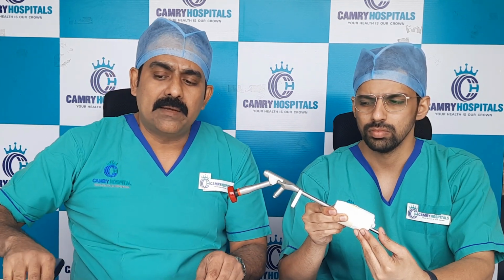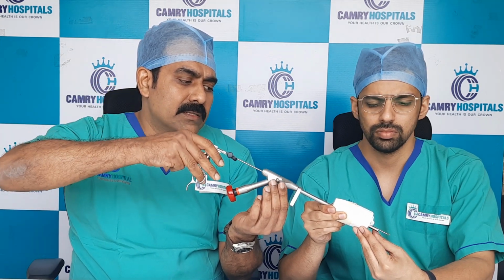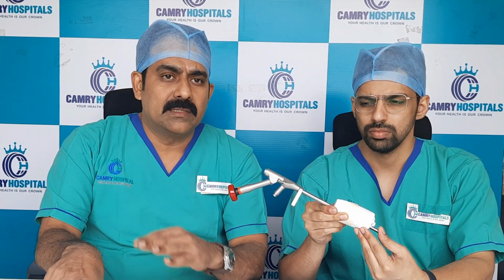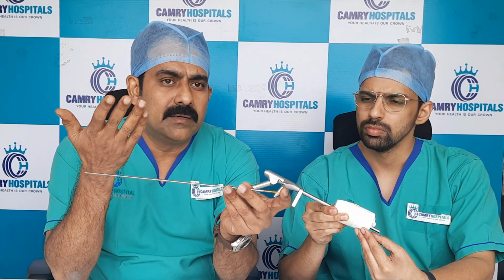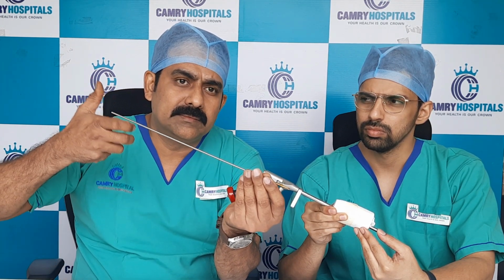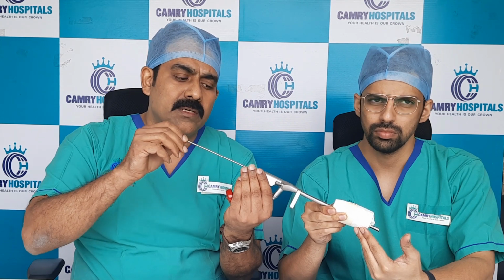And we use different types of instruments, to grab tissues, to cut the annulus. For tough tissues, these are really very strong instruments. In case some very strong bone is there, in older patients canal stenosis comes, for that we use what's called the endo burr. It is connected to a battery operated burr, then we go inside slowly, burr off the tissues and dilate the canal.